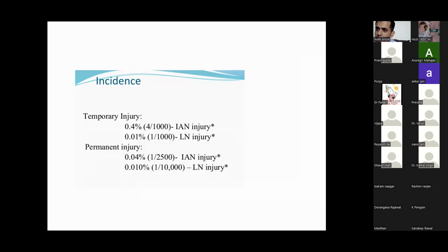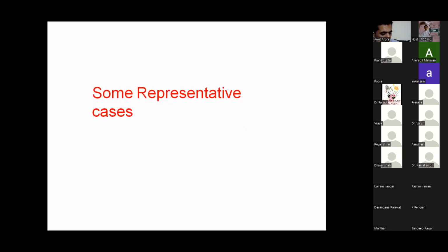So in such a scenario, you need to be very careful regarding the inferior alveolar nerve injury. You can avoid it by proper maneuvering, removing the distobuccal margin, dividing the tooth into proper halves, and delivering the tooth with minimal pressure, right? In cases of lingual nerve injury, you need to give proper local anesthesia. Do not go into the lingual pouch while using your micromotor or your physio dispenser. Do not suture without paying much attention to details in the lingual pouch. Okay, so these are the things.